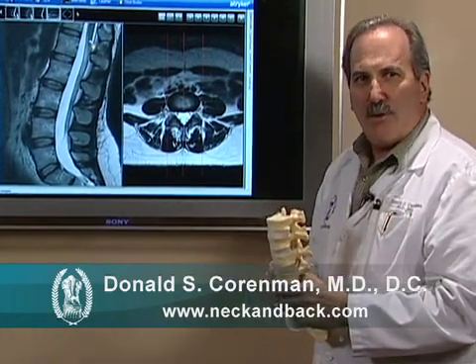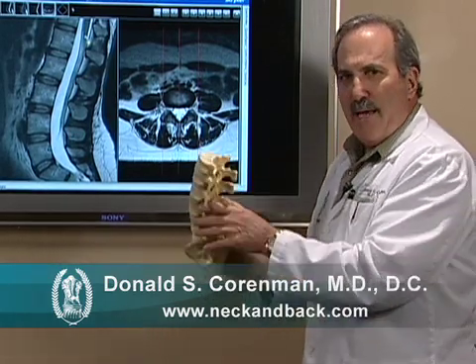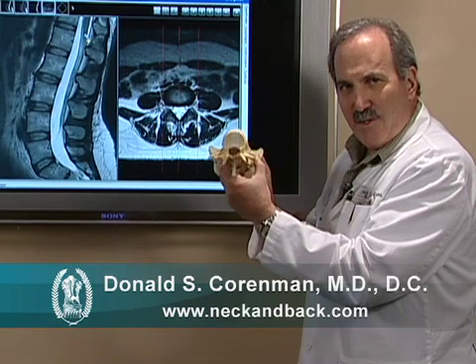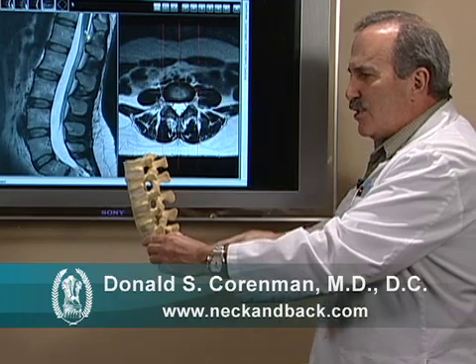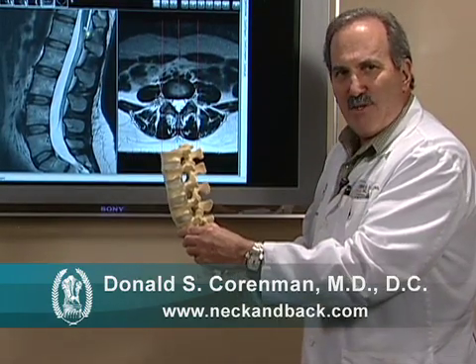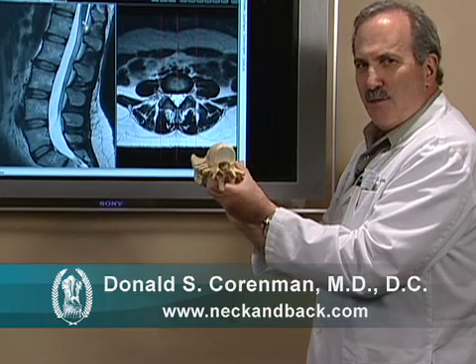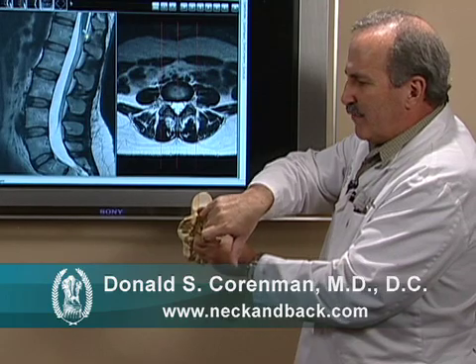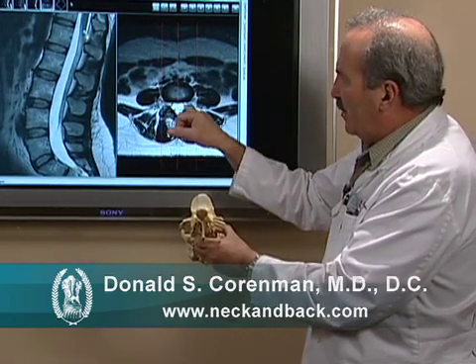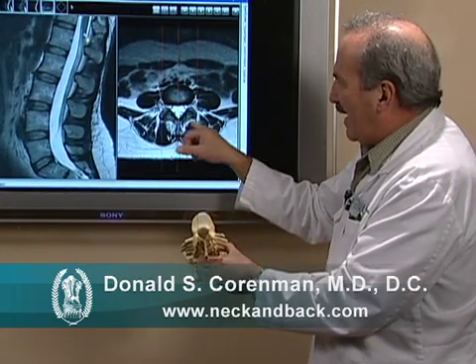The MRI essentially shows two separate views of the spine: a side view or sagittal view, and a bottom-up view called the axial view. On the side view, we slice the spine like a loaf of bread into different sections, represented here on the MRI. The bottom-up axial view shows the disc, the center of the canal where you see the nerves, and the two facets on either side in the back.